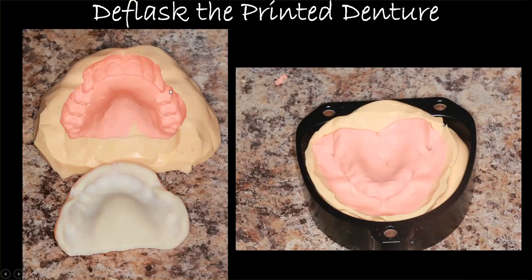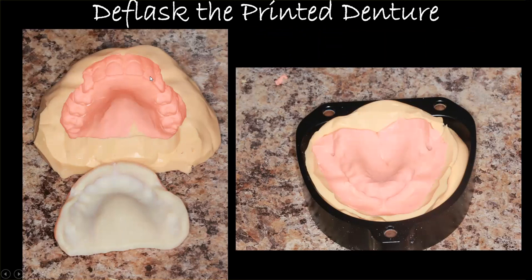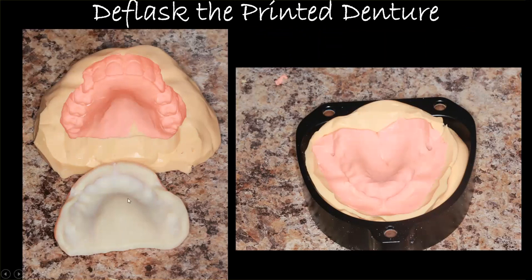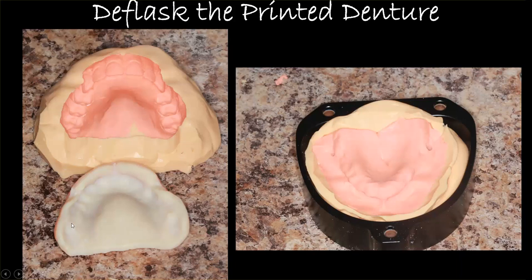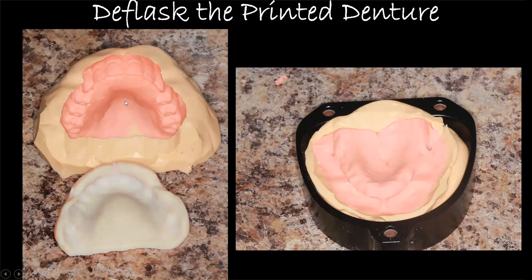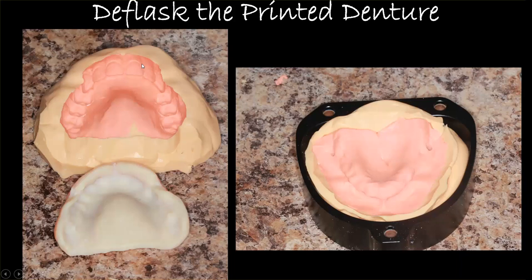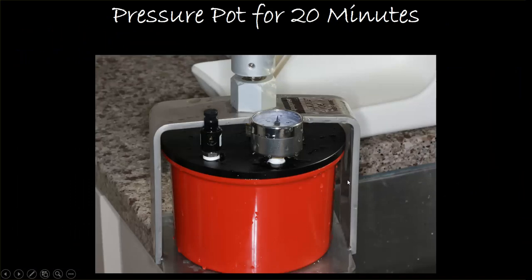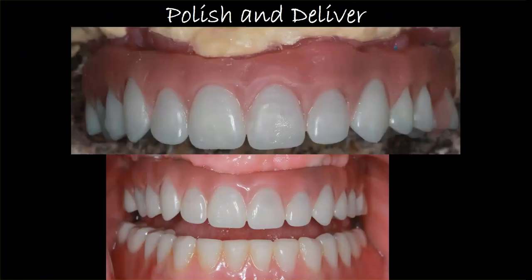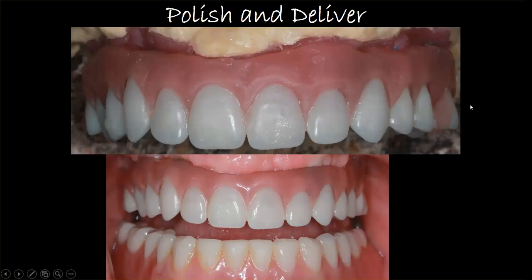The beauty of the digital setting process is that there will be a mold of teeth corresponding in real life to the digital teeth you set. You grab that mold of teeth, take them off, and individually pop them back into the slots. You close up the flask, inject the acrylic, and put it in a pressure pot for 20 minutes. This is all very simple — it could be completely assistant-driven.